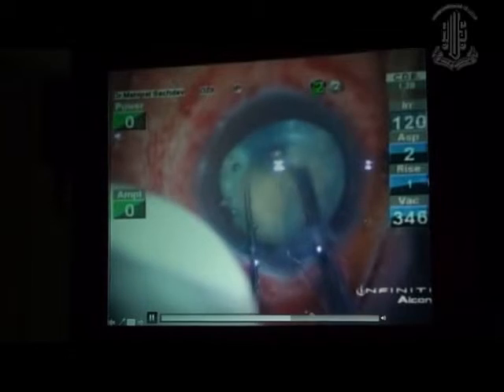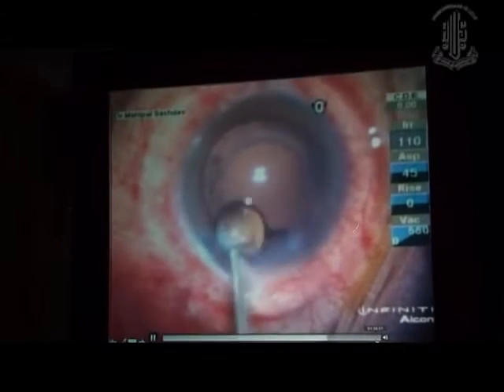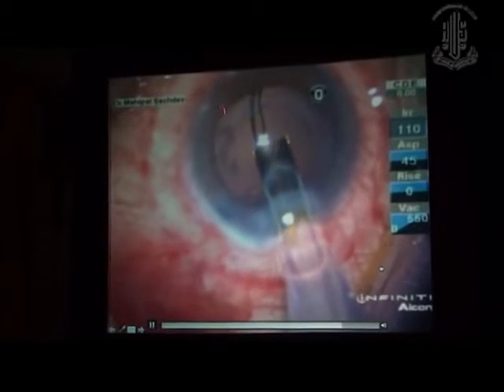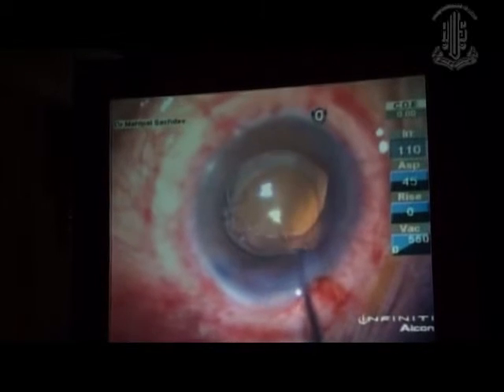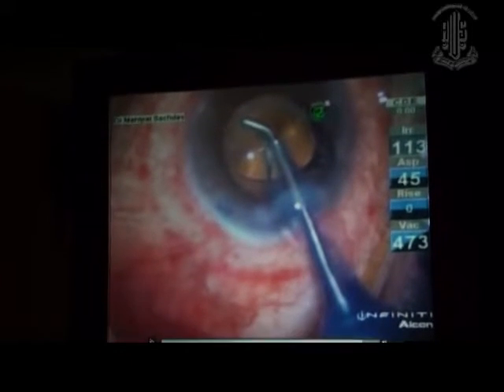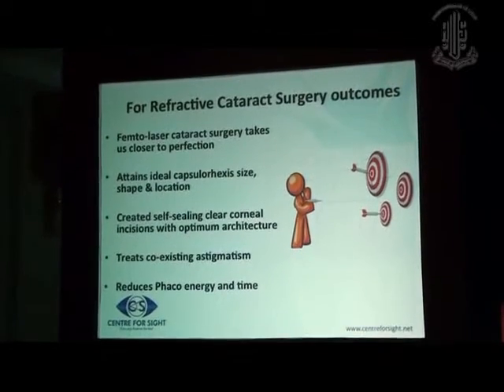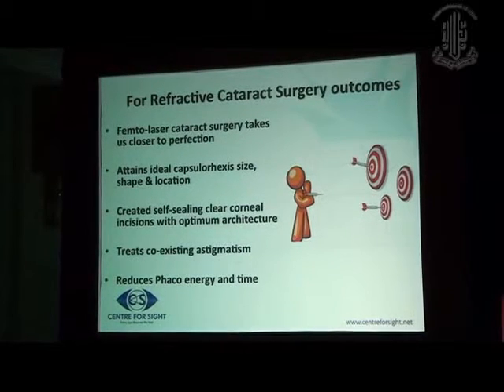So, friends, you can see in these particular cases, this is the end. You can see the round capsulorhexis, perfect. Despite being a very difficult case, there you can see this is all fibrotic. This is all fibrosis of the capsule which was there pre-operatively in this particular case. So you can do it in small pupils. You can also do removal of silicone oil. The LRIs that we do in these patients give you a fantastic refractive result.